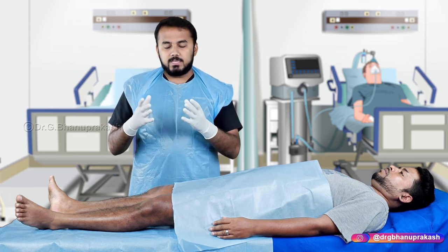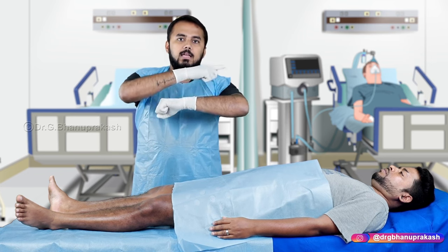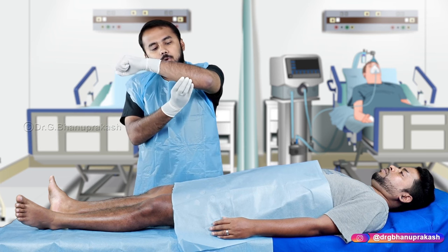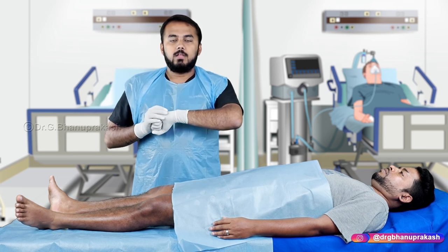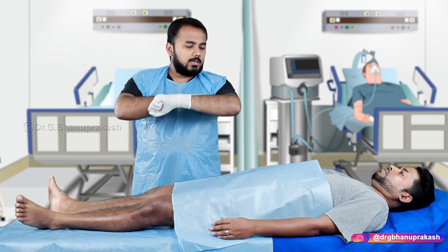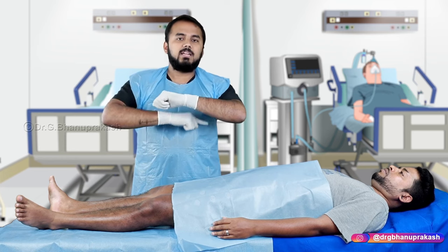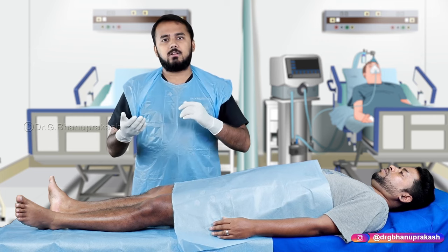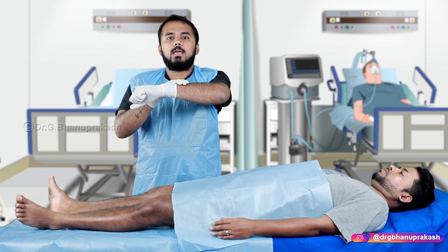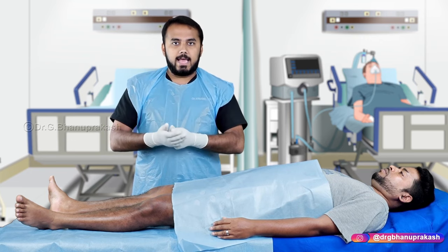There are two ways to apply POP: you can apply it completely circular — enclosing the full circumference — this is called a cast. Or you can apply it only partially, leaving one surface free — this is called a slab. Complete circumference is cast; partial or incomplete circumference is slab.